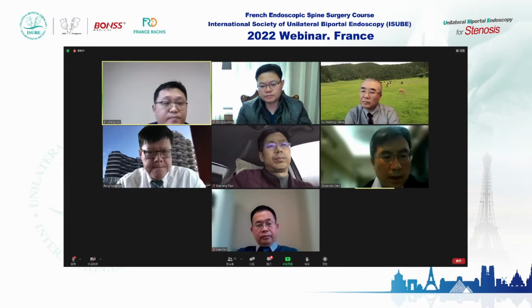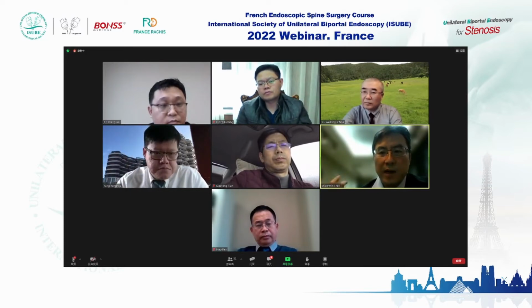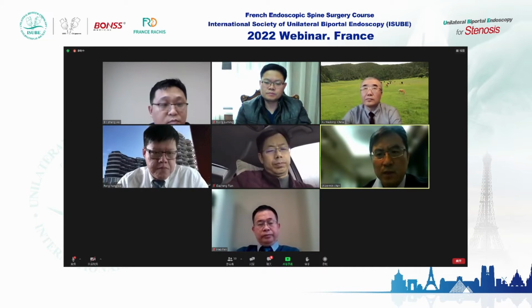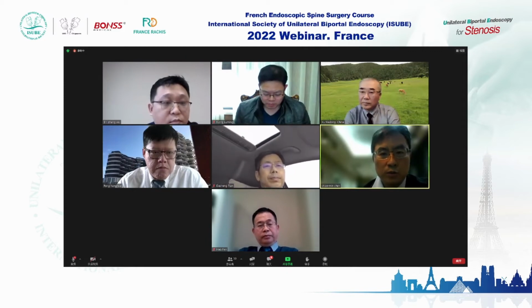No. I think if we remove the membrane, it will cause bleeding. That's because they have the structural problem. They already have the congestion problem, so it will cause bleeding. But our endpoint is to relax and let the vessel not have congestion in the foramen area. I think that is a very important endpoint for our decompression. So I'm not sure. Maybe Dr. Song, for the safety problem, keeps the membrane and only removes the bone structure. So maybe she has another opinion.